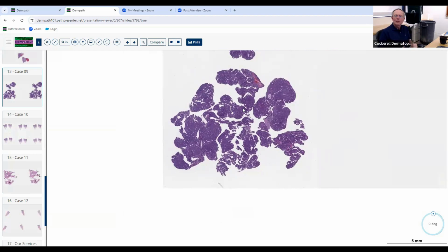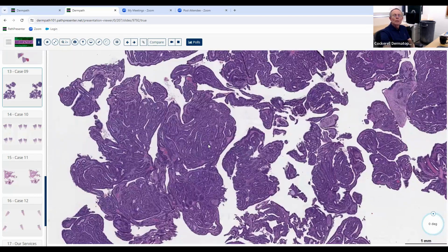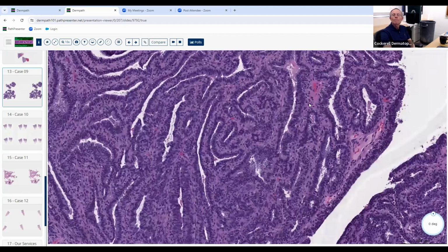It sort of looks like it may have been some kind of either something that was, like I said earlier, maybe it's pedunculated and they just kind of saucerized it. It seems like this may be the whole thing, but we're not sure. So we're going to probably have to use some ancillary criteria. We're going to have to see if they're mitotic figures, if there's necrosis en masse, pleomorphism, some of those things at higher magnification. So as we go to higher magnification, now we see it's got this glandular morphology.